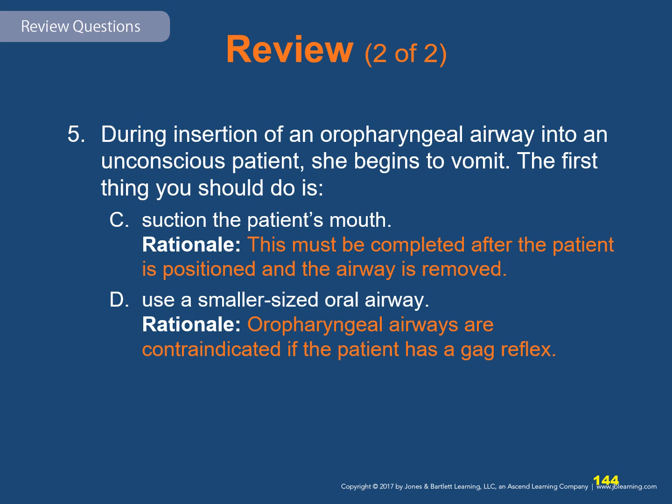D, use a smaller sized oral airway. Oropharyngeal airways are contraindicated if the patient has a gag reflex. If you put in an oropharyngeal airway and the patient vomits, they have an active gag reflex. You're going to have to use a nasopharyngeal airway.